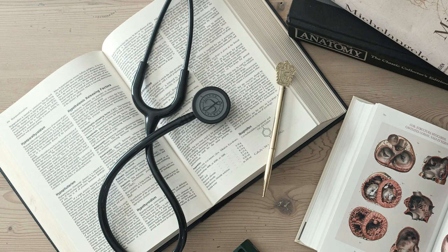It aims to resynchronize ventricular contraction, literally ensuring both ventricles contract simultaneously and more effectively. This can significantly improve systolic function, reduce heart failure symptoms, improve quality of life, and even reduce mortality in appropriately selected patients. It's a really important therapy for heart failure patients with LBBB and reduced ejection fraction.